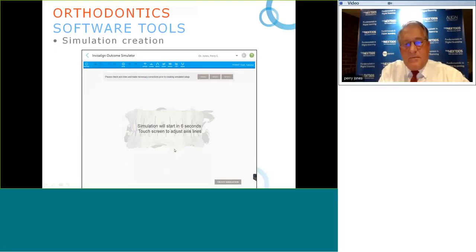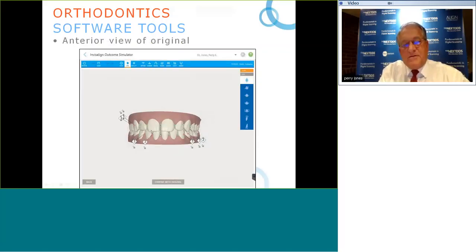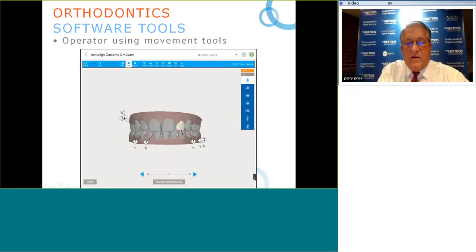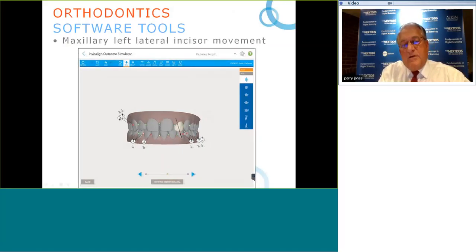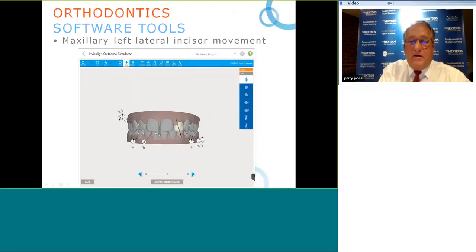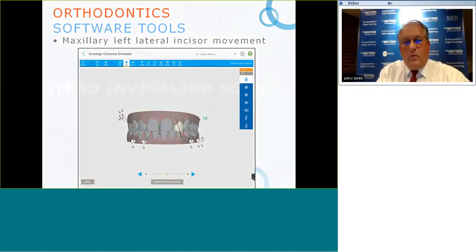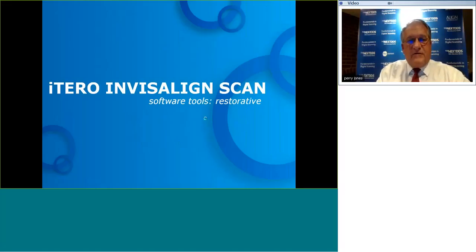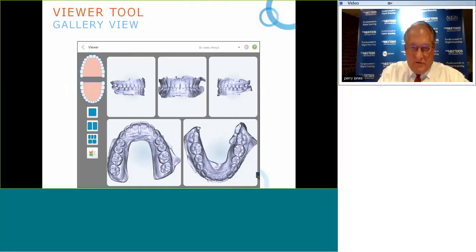In the outcome simulator, we create axis lines showing the long axis of teeth, and in about six seconds generate a virtual representation of the start position. The doctor can then use tools — such as an extrusion/intrusion tool — to create movements and show the patient improvements to anterior incisal edge proportion, representing in virtual world the desired outcome of the case.